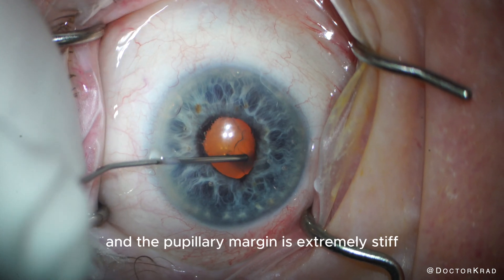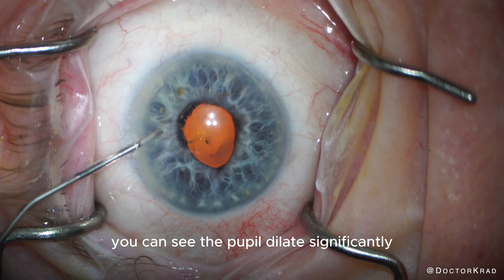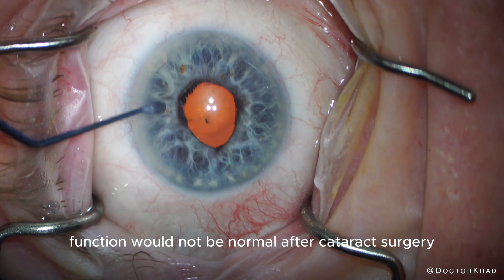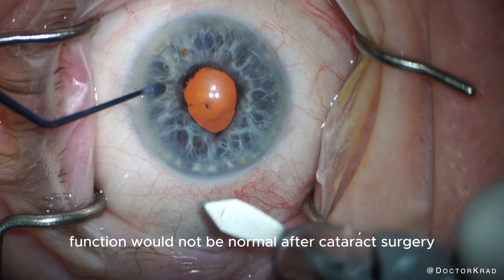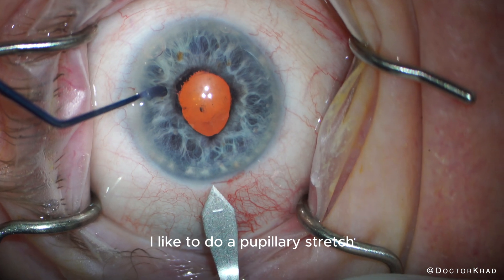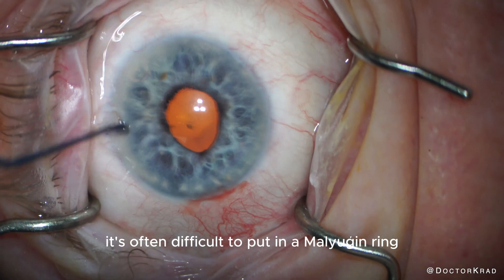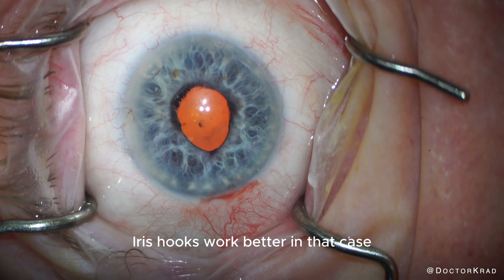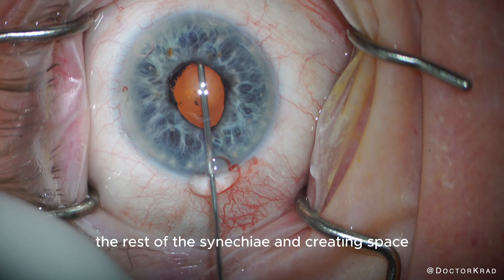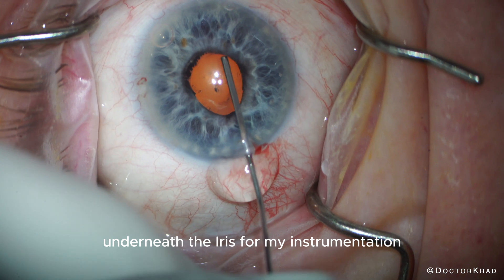The pupillary margin is extremely stiff. Sometimes, once you break up those synechiae, you can see the pupil dilate significantly, but this was very rigid. I could tell that the pupillary function would not be normal after cataract surgery, despite breaking the synechiae. So in those cases, I like to do a pupillary stretch — that softens the pupillary margin. With a rigid pupil, it's often difficult to put in a Malyugin ring; iris hooks work better in that case, unless you stretch out the pupil first. Here, I'm separating the rest of the synechiae and creating space underneath the iris for my instrumentation.